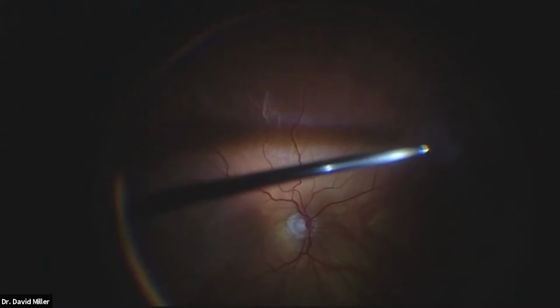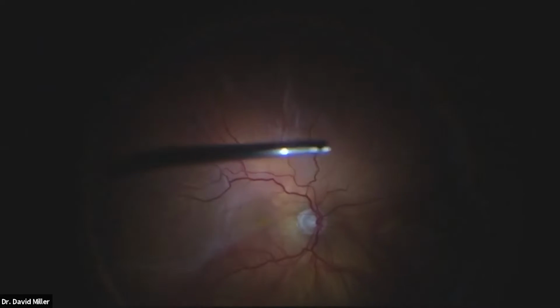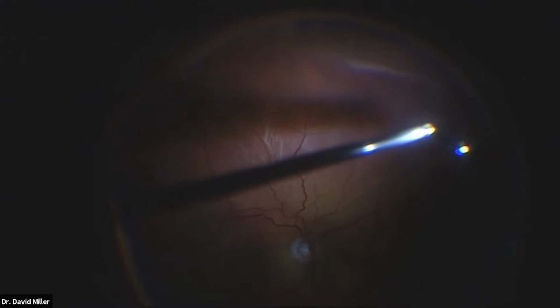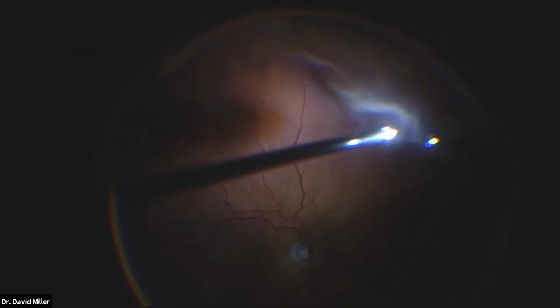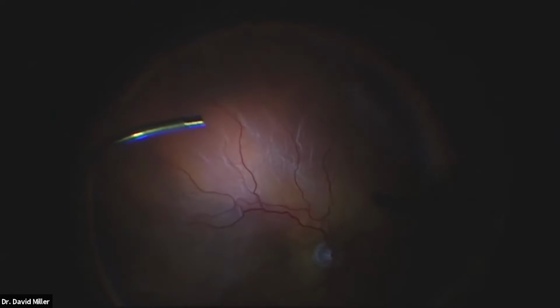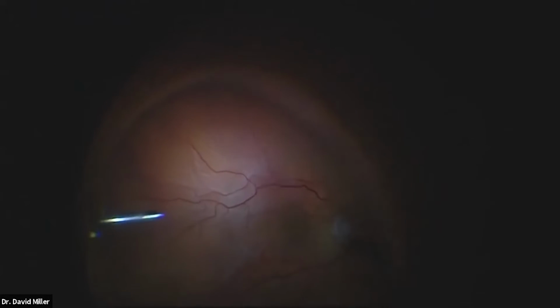So sometimes when we already developed, one thing we noticed is that the eye wall is unfolding a little bit more than usual. What I didn't check before I sat down was the height of the bed versus where I normally sit in the bottle chamber. And that can affect intraocular pressure. I'm on a Dorc machine, the EVA. And though it's a pressurized infusion, bottle height compared to eye height still counts. So we're going around the eye, getting the vitreous skirt out very nicely.